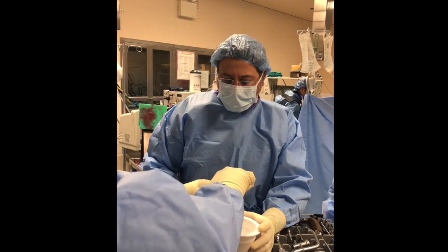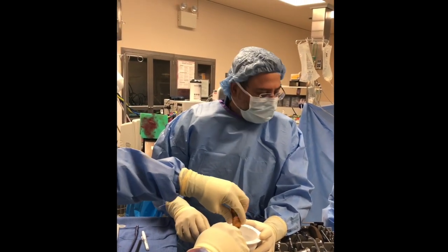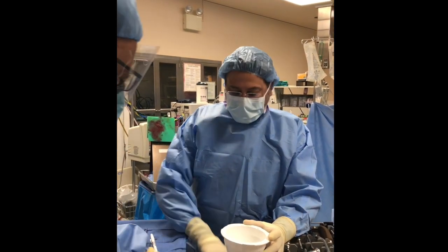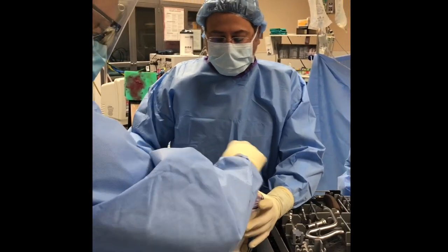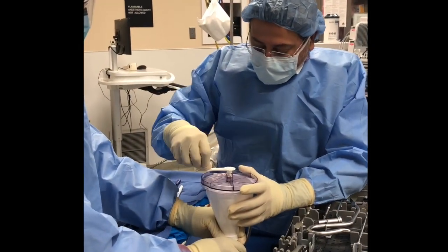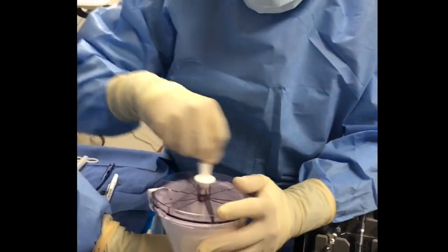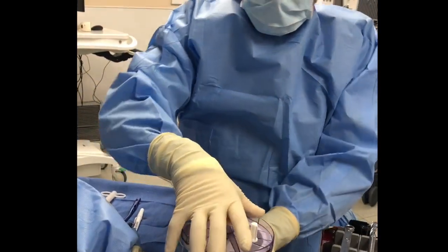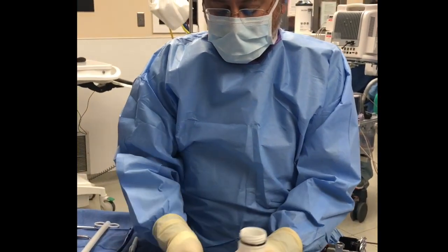Go ahead and put that in there. Often I take a little bit of the powder out, but Paul probably forgot to do that — but it's okay. Mix that up, Paul. We don't vacuum mix because we want it to be porous. Push there, suck that out. I don't wait too long; I just get it right out of there.